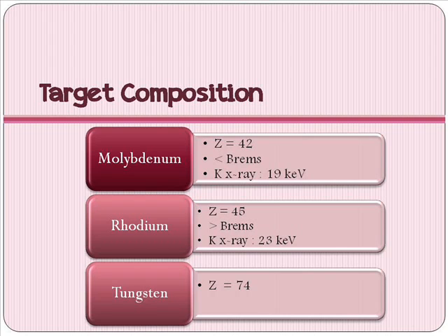Tungsten is not usually used for mammography because the Z number is very high. Okay, molybdenum and rhodium can produce characteristic X-rays that are near the optimum energy for mammography. Thus, both of these compositions are usually used in mammography, but not tungsten.